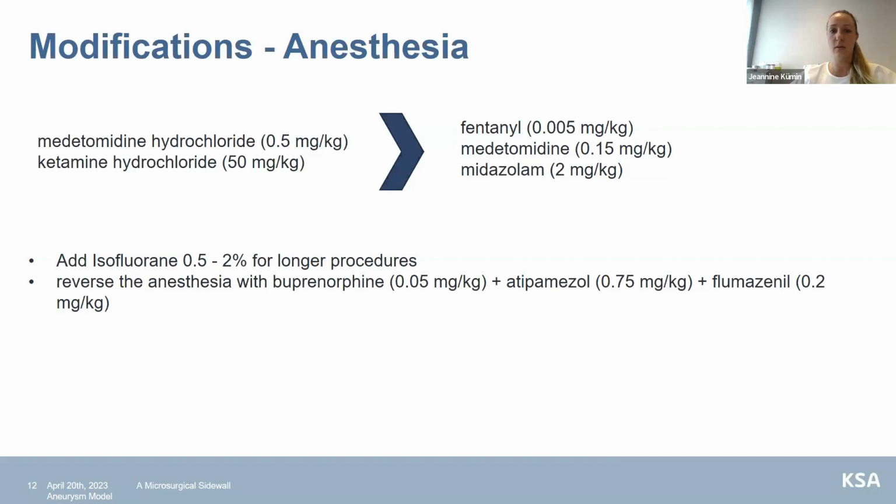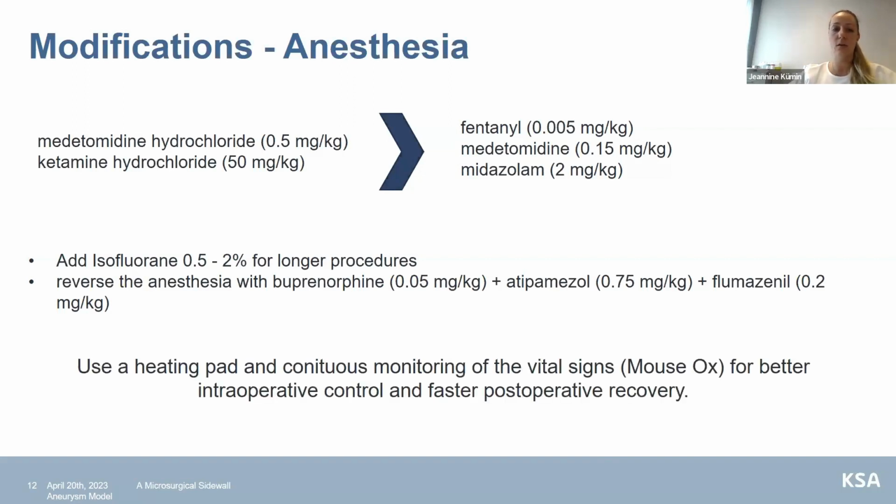And therefore, we used a mixture of buprenorphine, atipamezole, and flumazenil. And we also started to use a heating pad and continuous monitoring of the vital signs to have a better control over the anesthesia depth, as well as for a faster and better postoperative recovery of the animals.